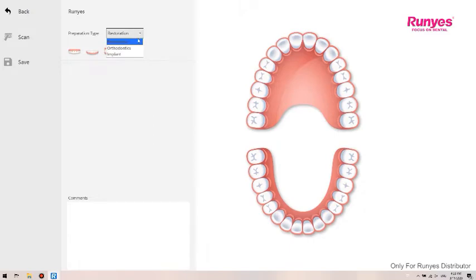The software provides 3 scanning methods: restoration, orthodontics, and implant. The scanning process of restoration and orthodontics is the same: upper jaw, lower jaw, and occlusion, but restoration has higher accuracy in analyzing the data of a single tooth. Orthodontics has higher accuracy in the data on the dental arch.